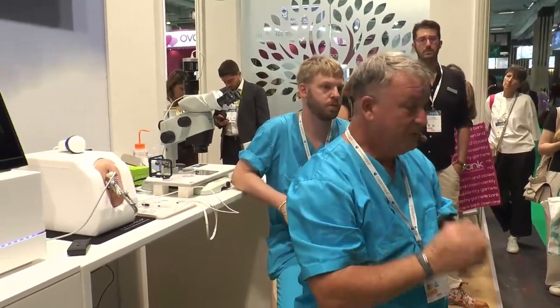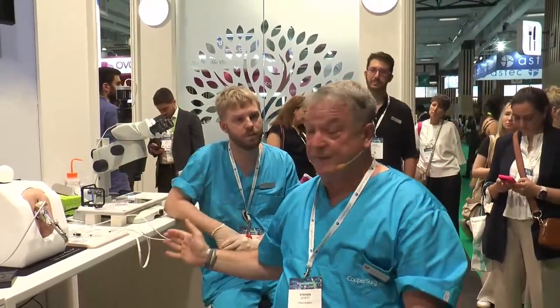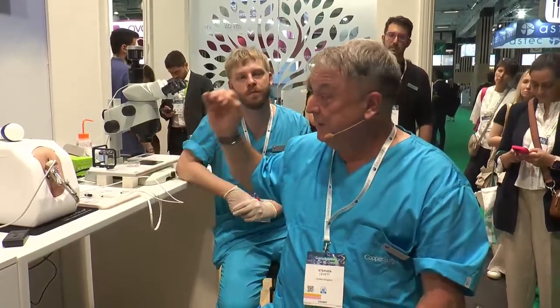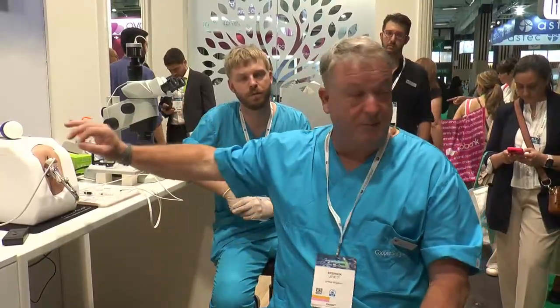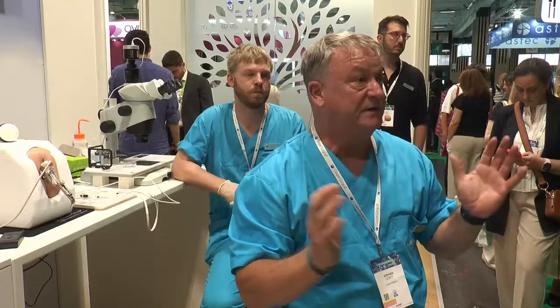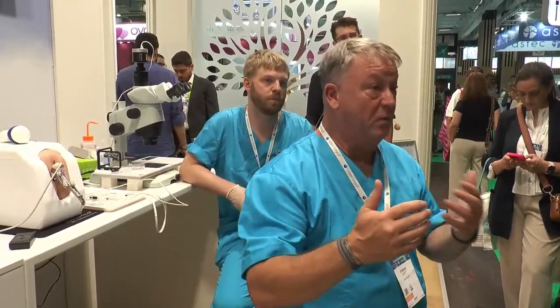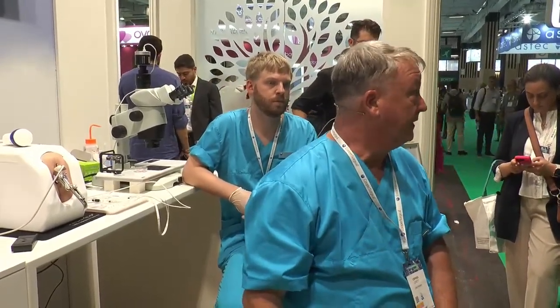So hopefully we've got a great quality embryo. We've loaded the catheter with the optimal embryo transfer medium. That's done quickly, brought it through to the operating room. The person doing the transfer does an easy transfer like that. We've got the best chance of the patient achieving her goals. If any of those things don't work effectively or optimally, then the chances of success are going to diminish.